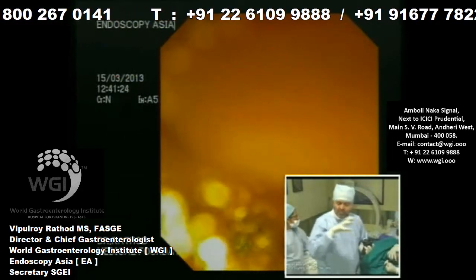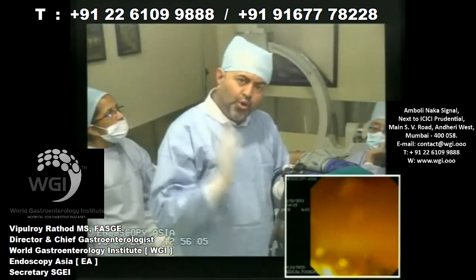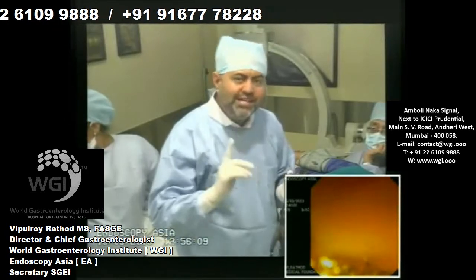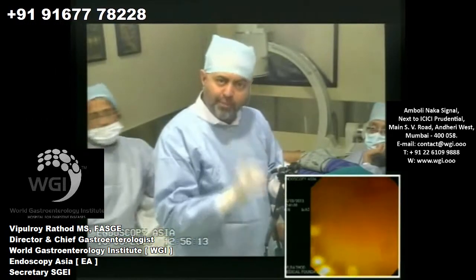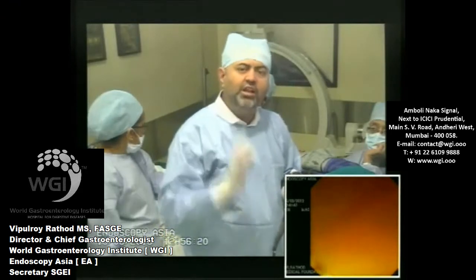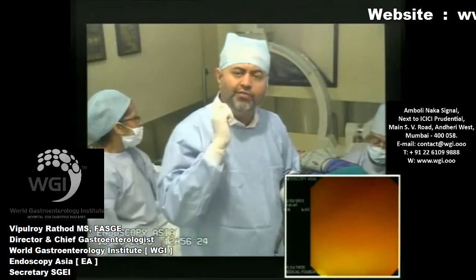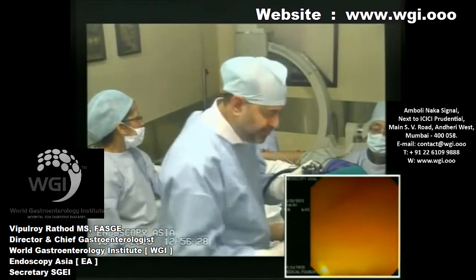If I see a bulky pancreatic lesion like an inflammatory mass, we will go after it, especially from the stomach, with a 19 gauge needle. A 19 gauge needle from the duodenum can be a formidable task, and those who are beginning their career in EUS-FNA should not use a 19 gauge needle in the duodenum. You will damage the channel of your scope, and you will have serious consequences because of that.